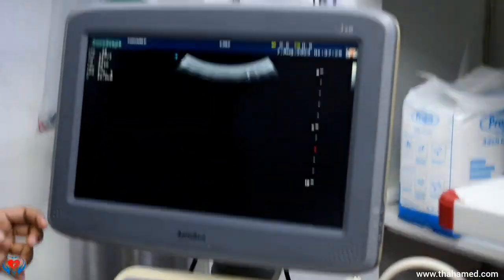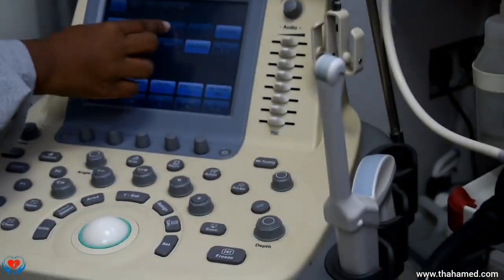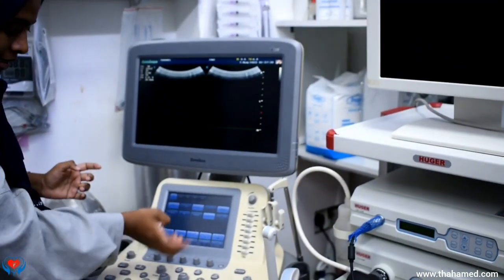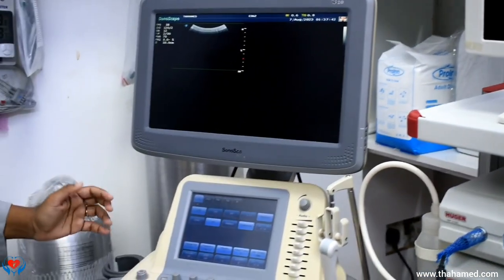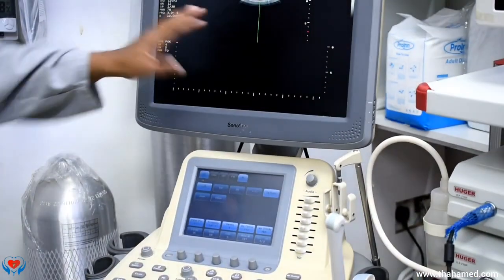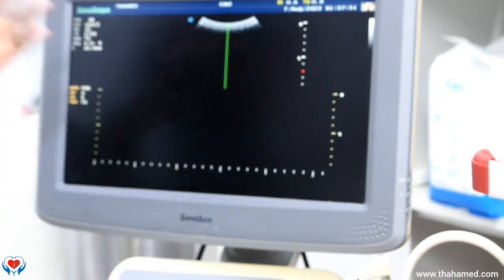There are some other keys like M mode or 4B. If we press the 2B mode, we can see two images, and then I am going to unselect it. If we press 4B, we can get different types of images also. There is another key, that is M mode. There we can see one static image and one motion image corresponding to the single page.